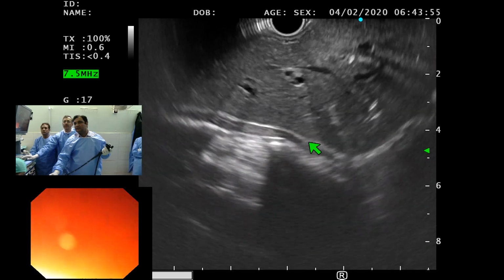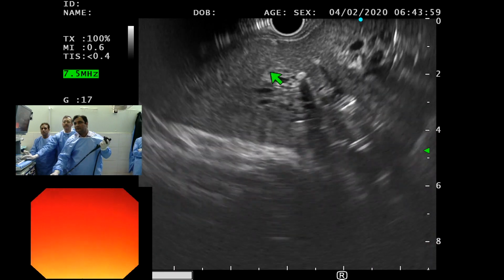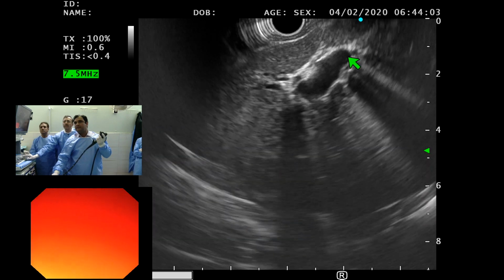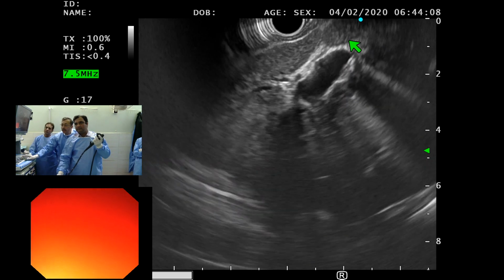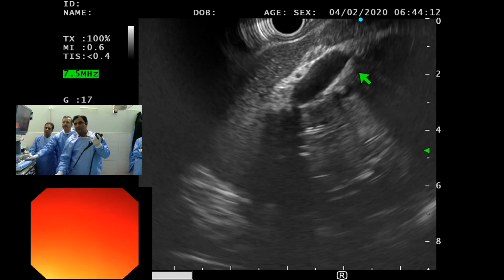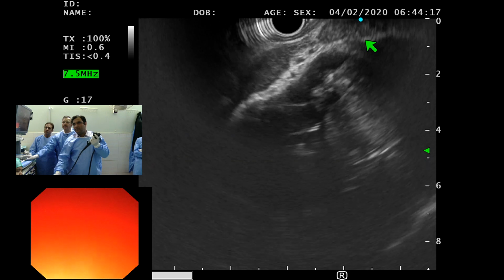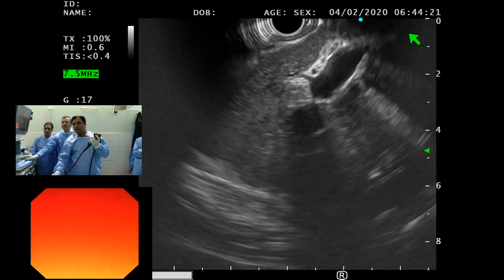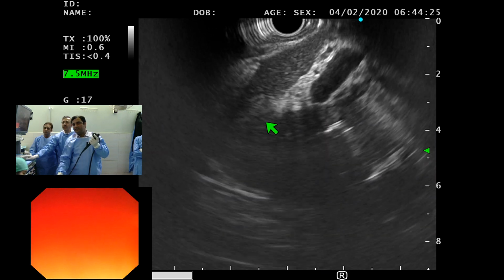This is segment 2, this is segment 3. No, this is ligamentum venosum, fissure, umbilical part. Ligamentum teres on this side.